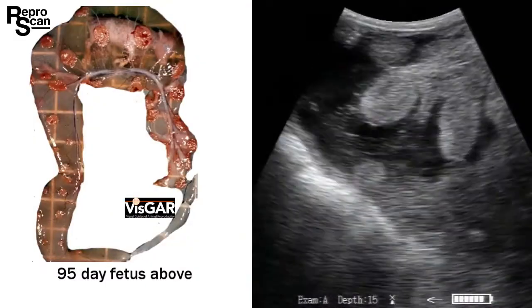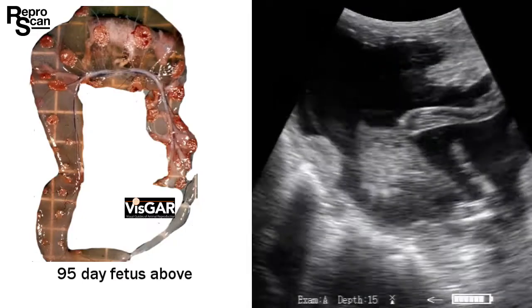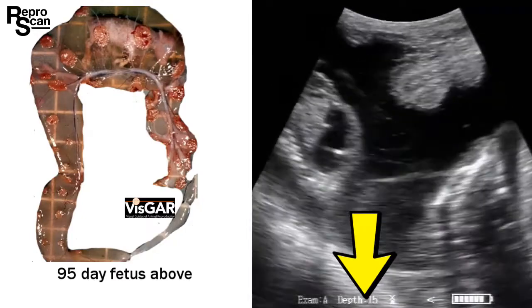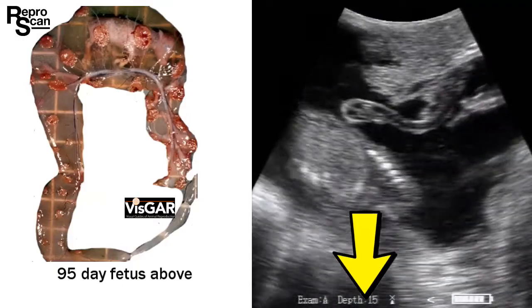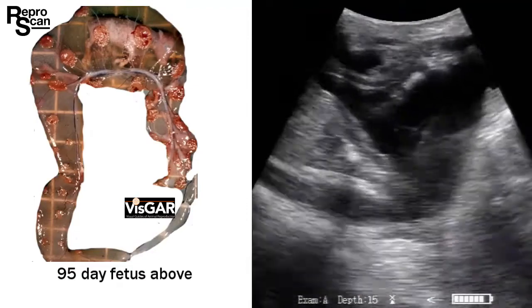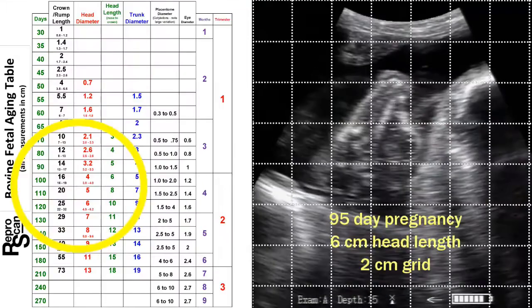Now with the Visgar dissection, you can see that the placentomes are getting much bigger. We've got a 15 centimeter depth setting. There's a much larger fetus. In the ultrasound image, the placentomes are much more visible. And we're just going to roll onto that head. We're going to get a head length of 3 squares, 6 centimeters, a bit less.